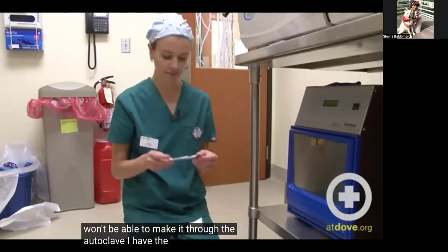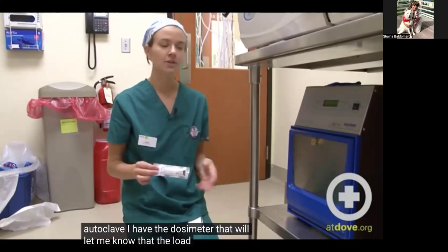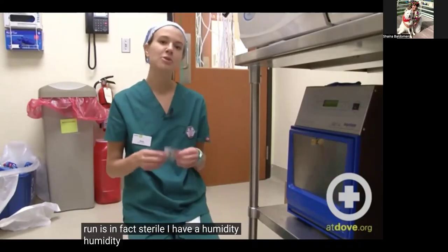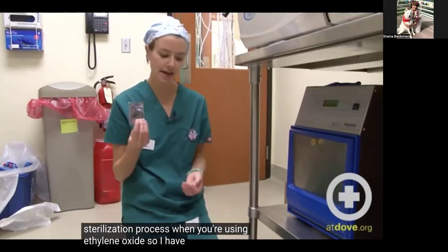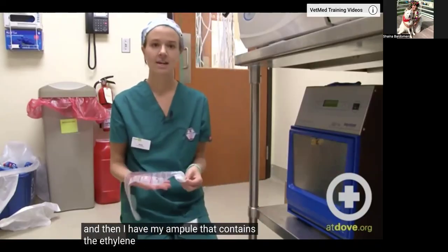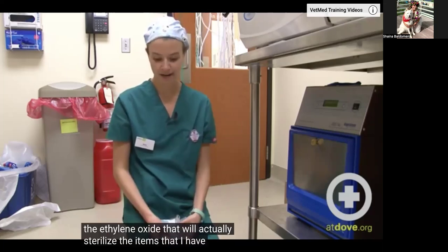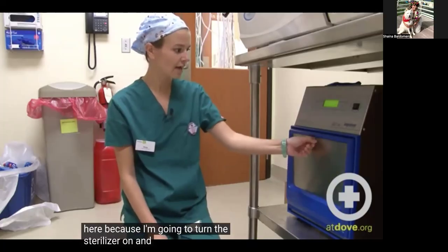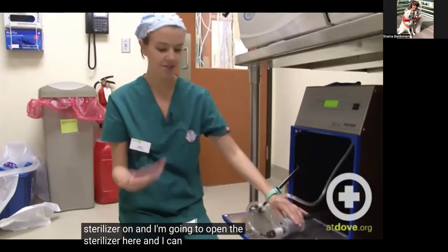I have the dosimeter that will let me know that the load that I have run is in fact sterile. I have a humidity chip. Humidity is very important to the sterilization process when you're using ethylene oxide, so I have one chip here. And then I have my ampule that contains the ethylene oxide that will actually sterilize the items that I have wrapped here. So I'm going to turn the sterilizer on, and I'm going to open the sterilizer here, and I can start loading my equipment.